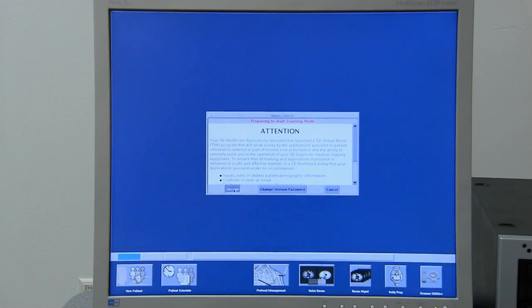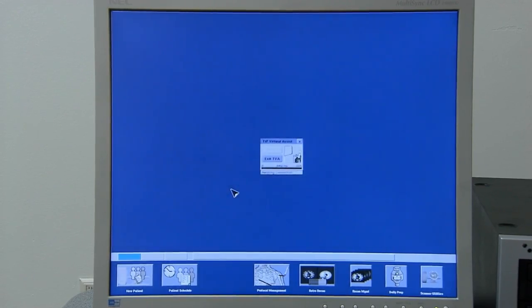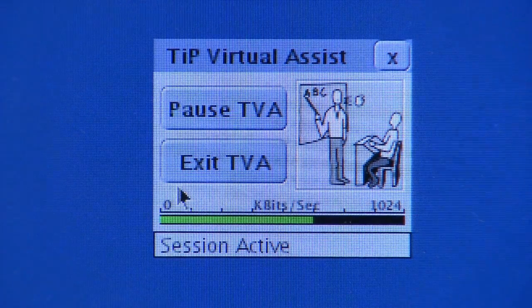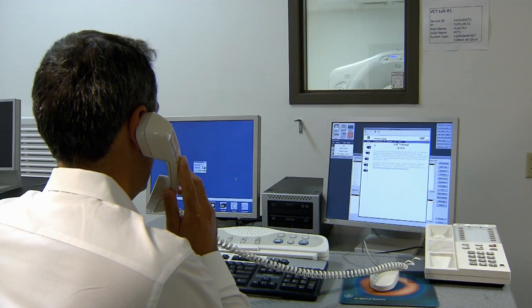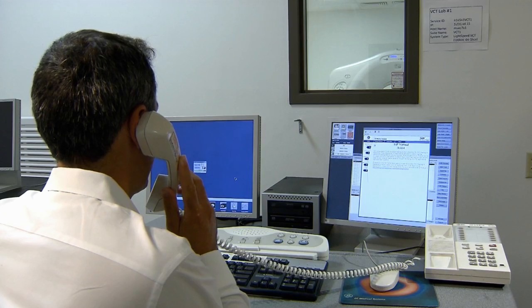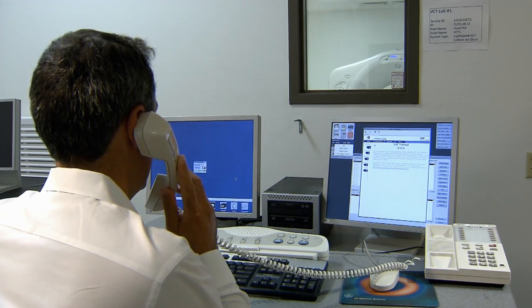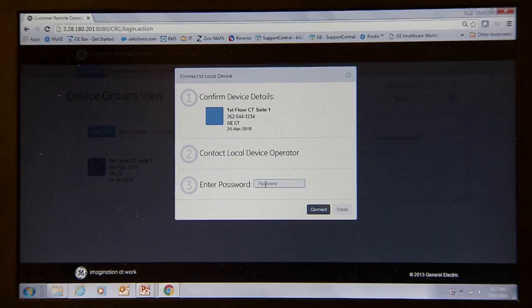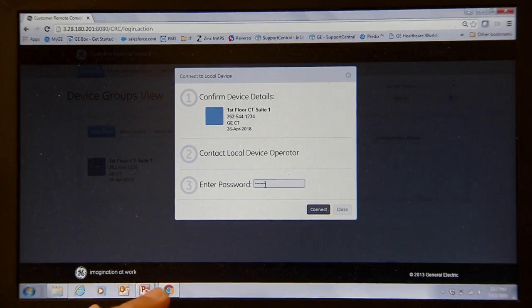The remote user must connect within two minutes or the technologist will have to re-initiate the TIP virtual assist session. The technologist provides you with a password for accessing the imaging device. Unless it has been changed, the default password is to get in.